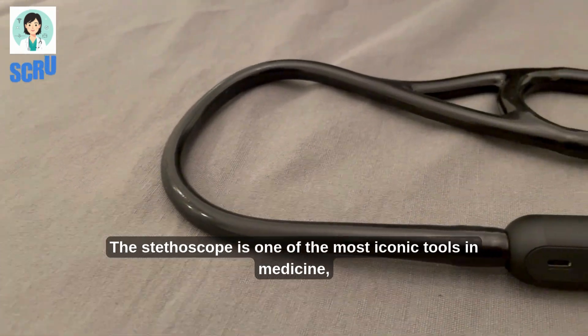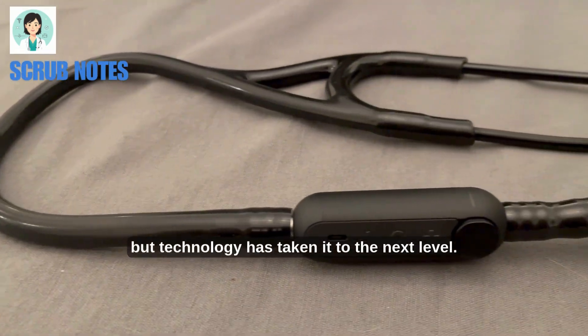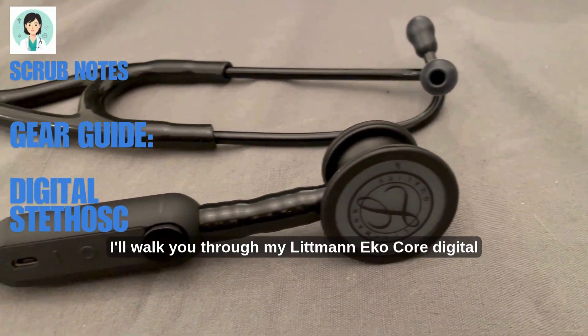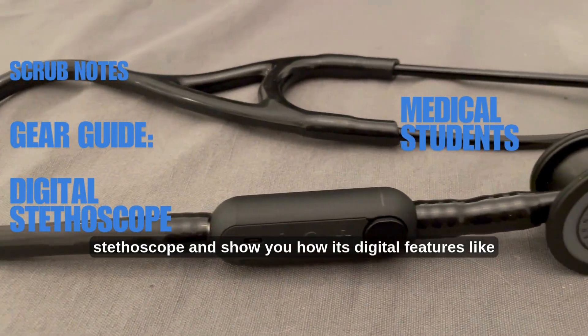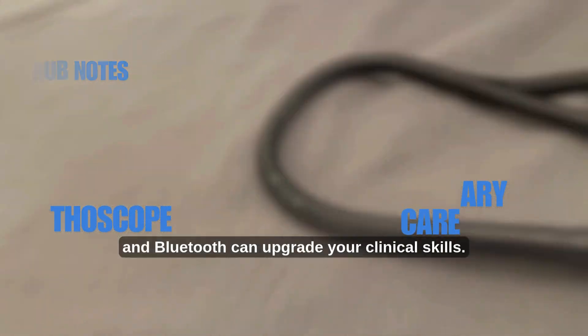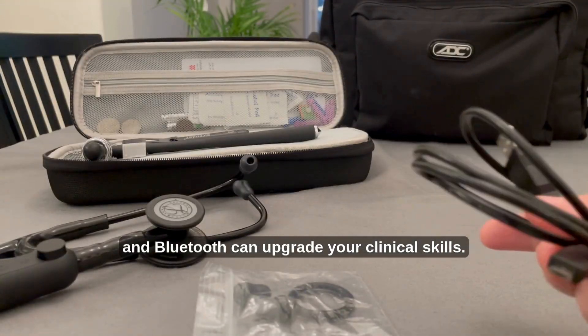The stethoscope is one of the most iconic tools in medicine, but technology has taken it to the next level. Today, I'll walk you through my Littmann Eko Core digital stethoscope and show you how its digital features like amplification, noise cancellation, and Bluetooth can upgrade your clinical skills.